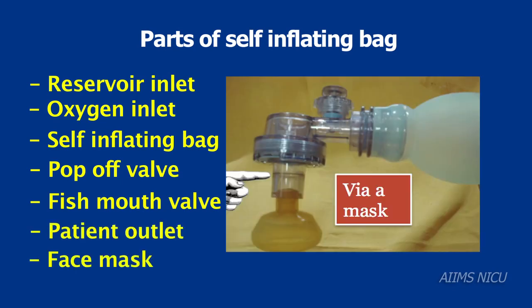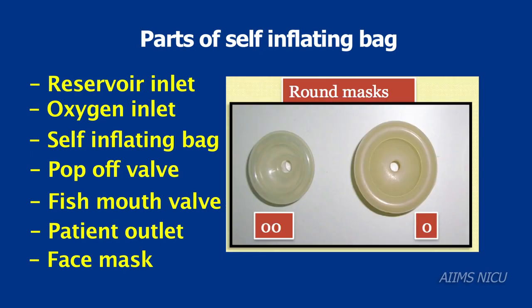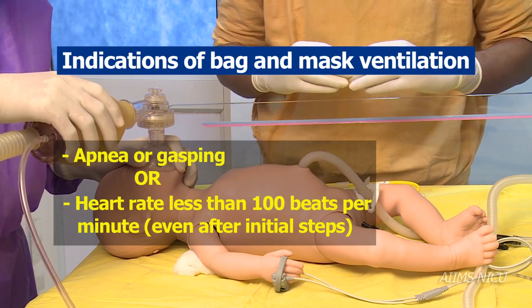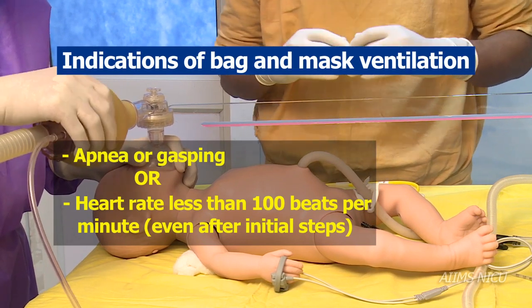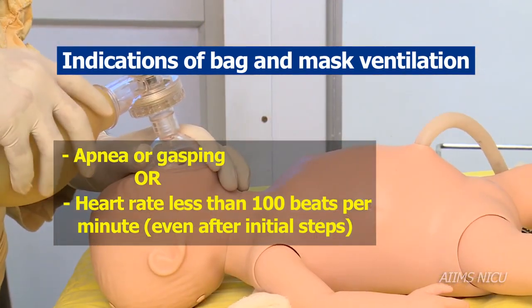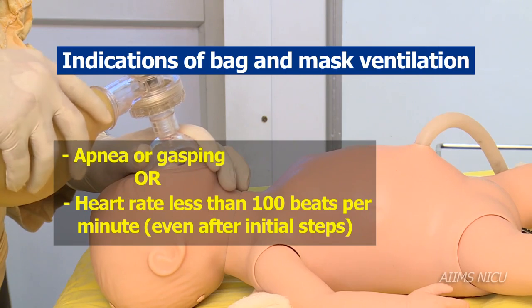The face mask is attached to the patient outlet and comes in sizes 00 and 0. The indications to use bag and mask ventilation include an apneic or gasping baby, or a baby with heart rate less than 100 per minute after the initial steps of resuscitation.